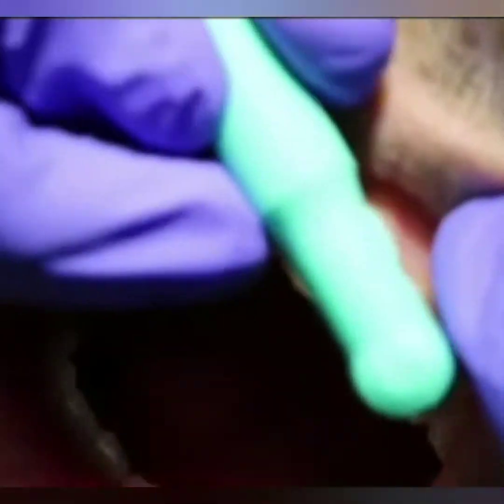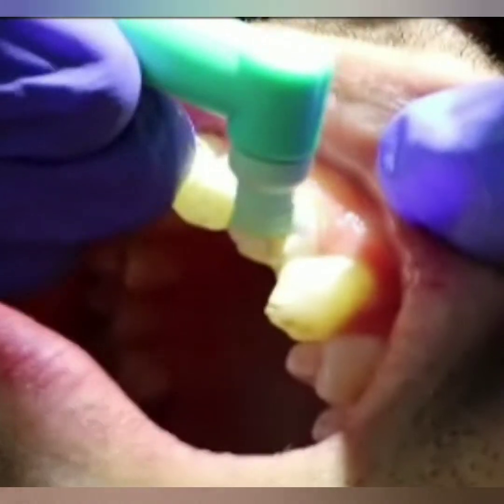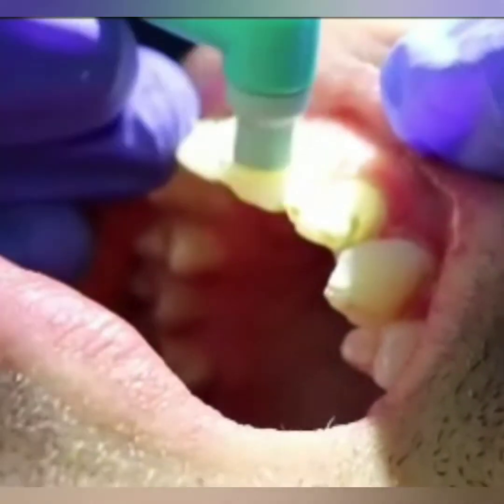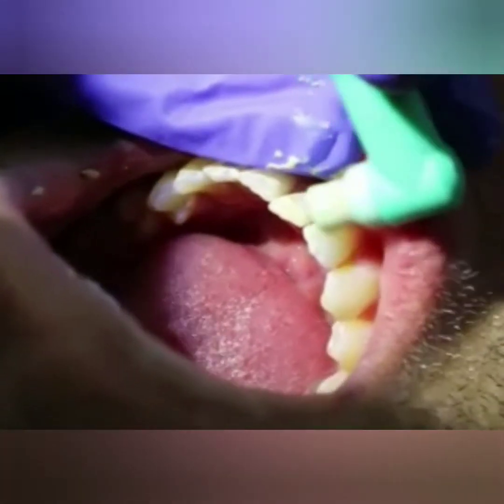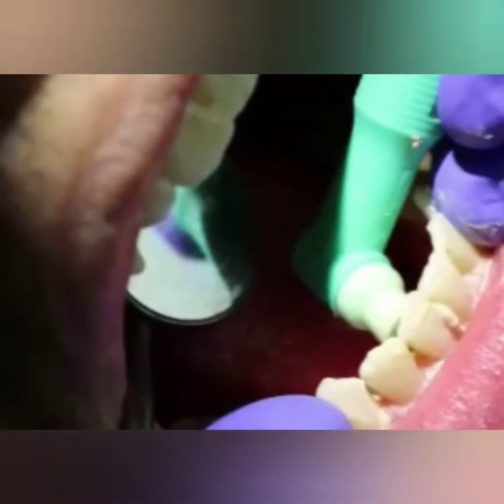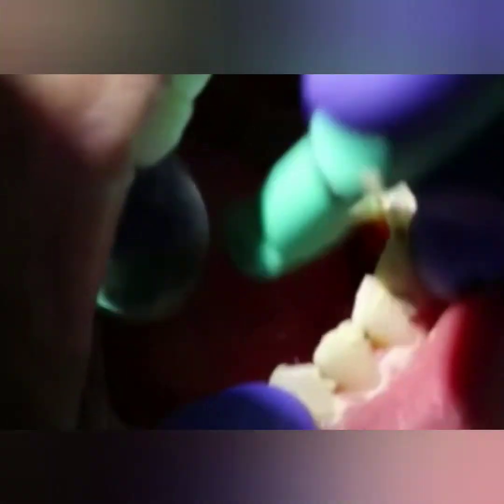After scaling is completed, polishing is a must. Take the polishing material, adapt it to the tooth surface, and give a distal stroke, central stroke, and mesial stroke. We have to cover all surfaces.